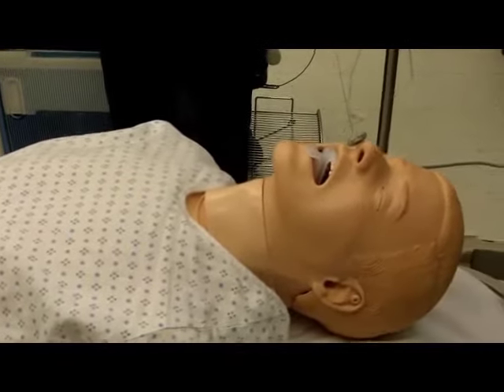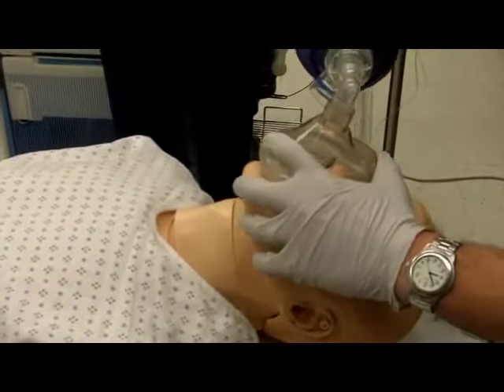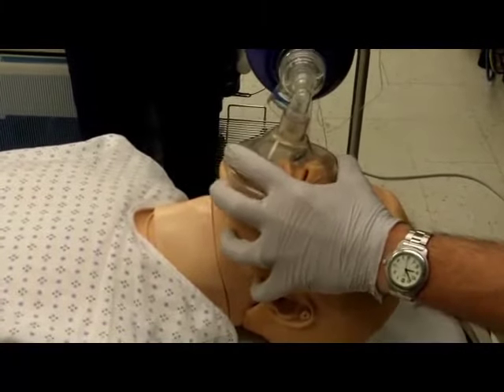Place the top of the mask at the bridge of the nose. Lower the bottom portion of the mask, covering the mouth and nose. Avoid downward pressure on the mandible.